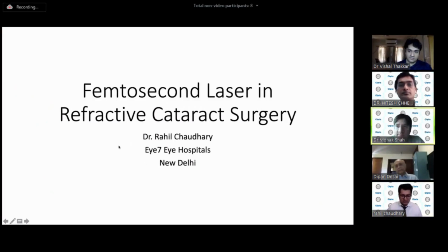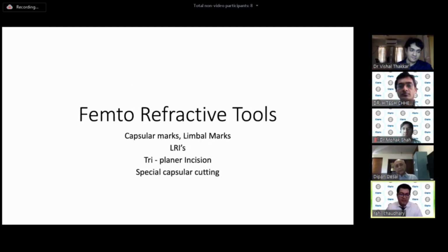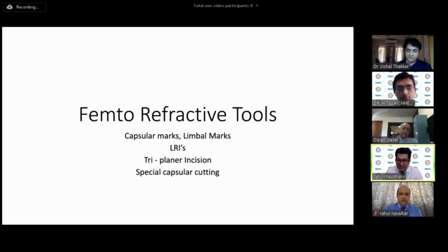Yes, perfect, sir. So I'll be speaking on femtosecond lasers in refractive cataract surgery. We'll be talking about tools that we have with femto laser that can be used to get excellent outcomes in cataract refractive surgery. Talking about femto laser, basically we have four kinds of tools that can be used.